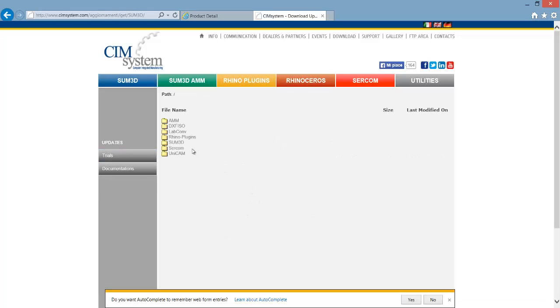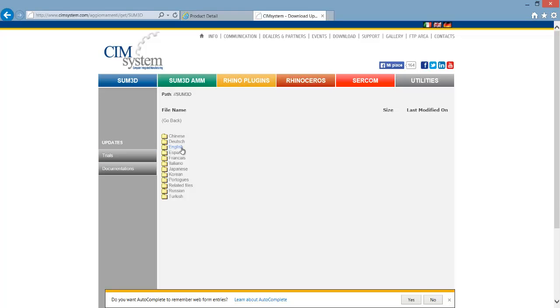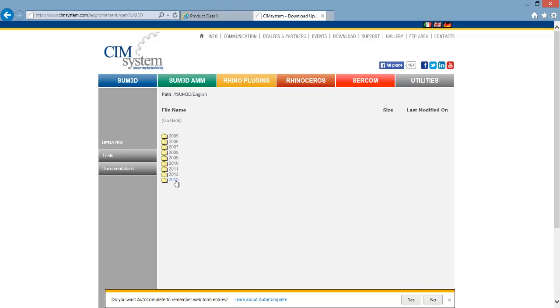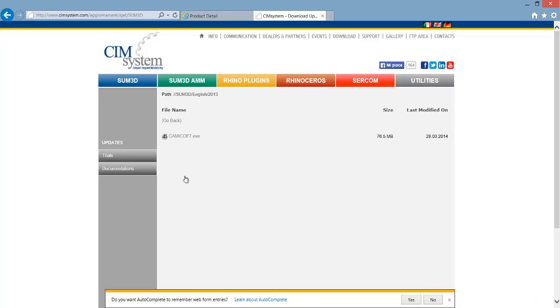When the next page loads, go to sum3d, pick the appropriate language, and then pick the appropriate year. And from there you'll have the most current installer to download.